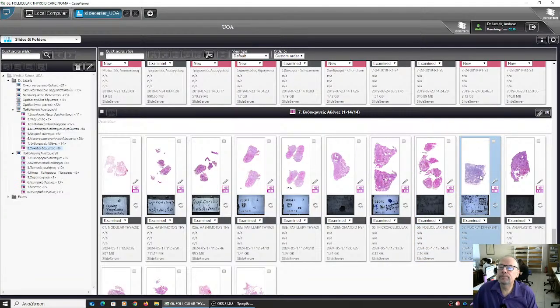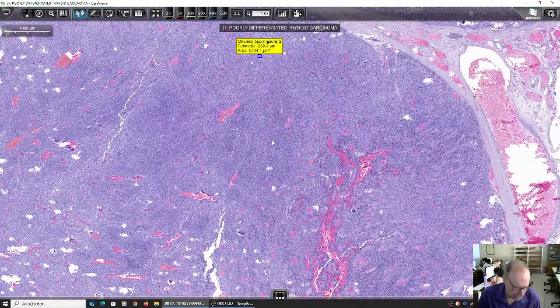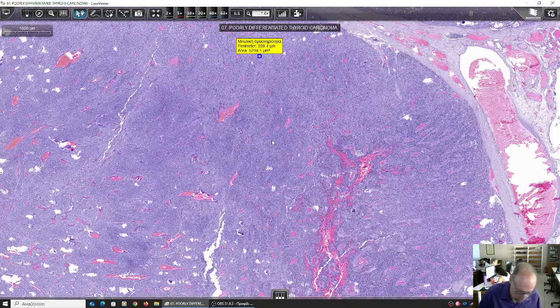This tumor may not express thyroglobulin, however, it expresses immunohistochemically another marker of thyroid follicular cell differentiation known as TTF1. So, now the grade has increased. This is no longer a well-differentiated tumor. It is a poorly differentiated tumor of follicular cell derivation.